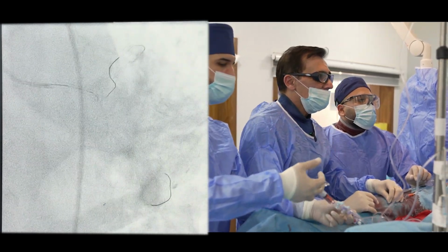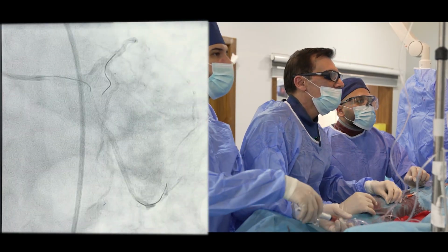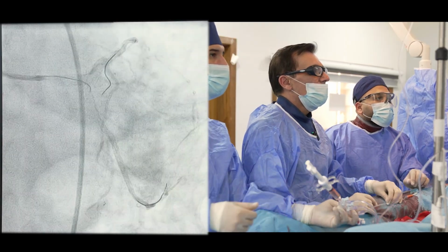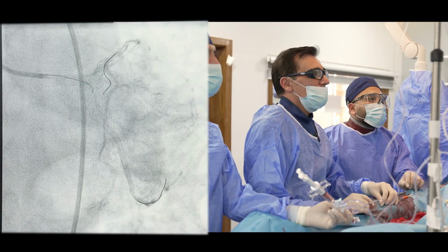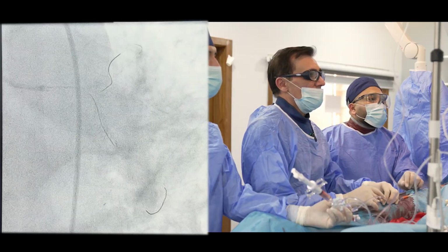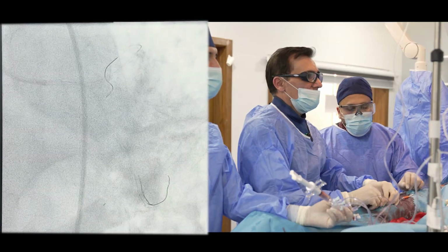Let's do angio here. There is a small area to decide whether we are distal strut or proximal. It seems to be okay. So you have to open the struts of the circ.